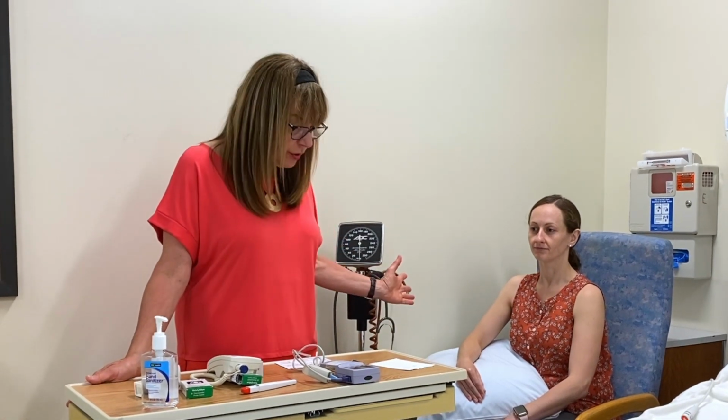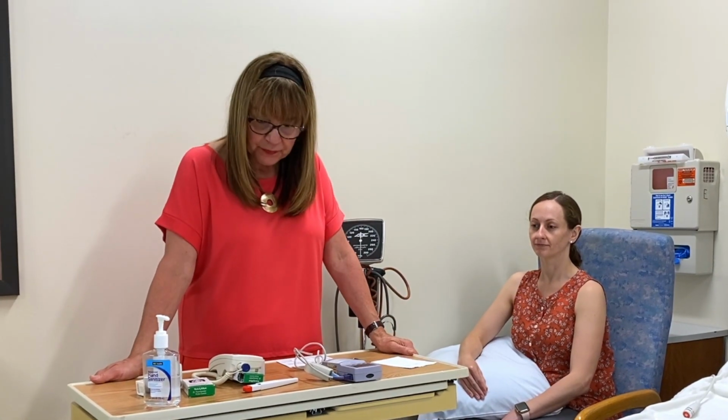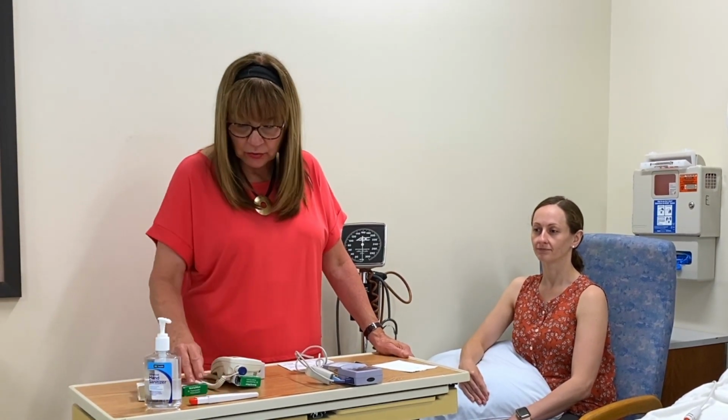So rectally, you will get a higher temperature, typically in the 99s, especially where hers was 98.2. And again, it needs to be cleansed, but that's another mechanism or a way to utilize temperature measurement.